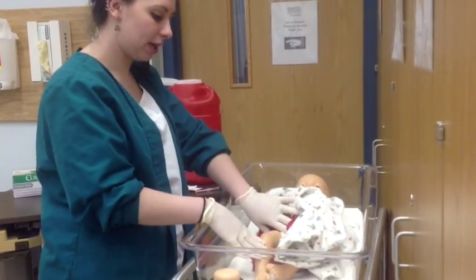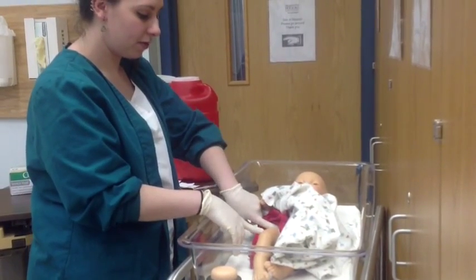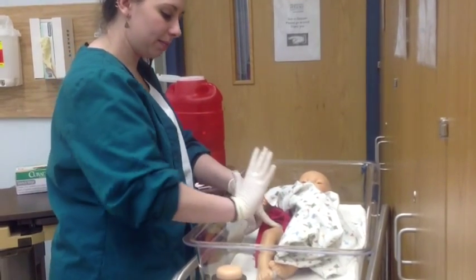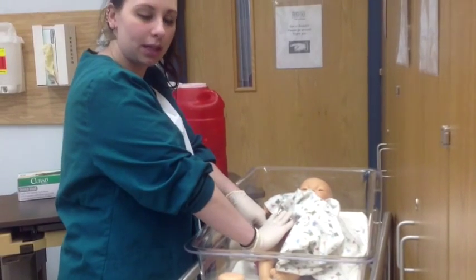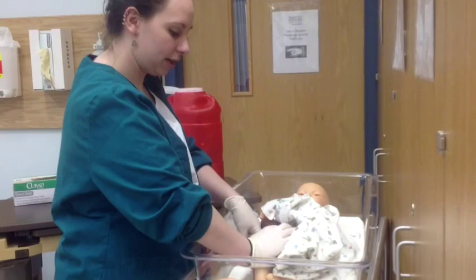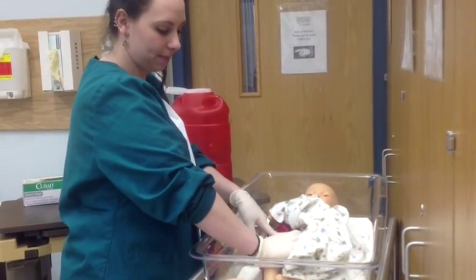But to map out the landmarks, you're going to find the knee and the top of the hip here for the thigh muscle. You're going to put your palm down and you want to firmly hold the leg because the baby's going to be really squiggly and wormy. So you want to make sure you hold it well, and then you take your fingers and spread the muscle. So it'll be just like this.